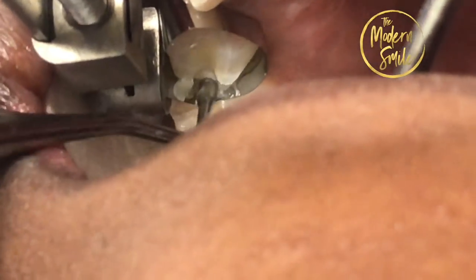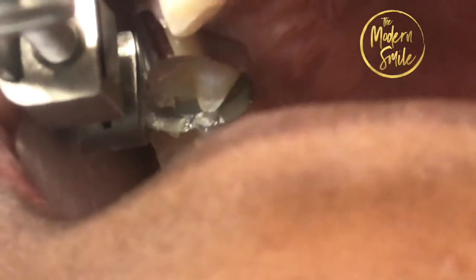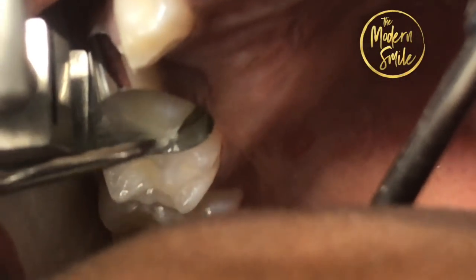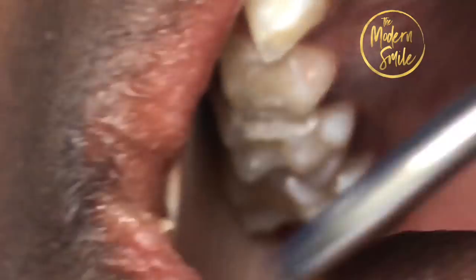Could you see the light when we were working on you? Yes. Okay, so now you're going to see me pack the white composite filling material into the teeth, and then you'll see me brush it and shape it. So you see how creamy it is, Genesis? And so now what is the light going to do? The light is going to make it harder. You're learning. So as soon as you leave, you can eat and drink and do all your normal activities. Remember, because we didn't give any shots or needles, there's really no necessity to say don't eat this or don't eat that.